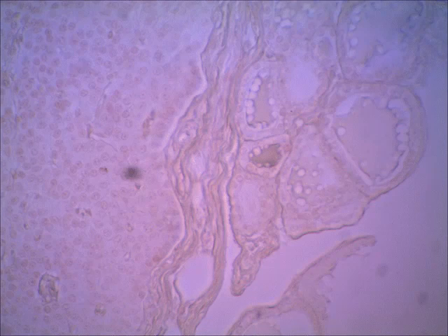And here it is on a higher view. I'm going to put some arrows on the cord-like arrangement of the parathyroid cells. You can see that. You see a little bit of the cord-like arrangement. And then over here to the right, there's a thyroid follicle. There's one. There's one.